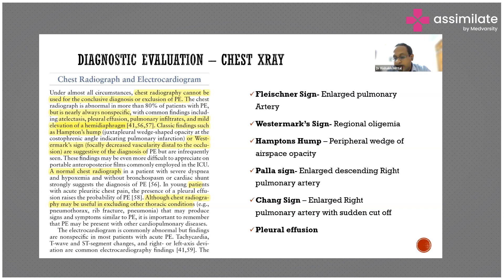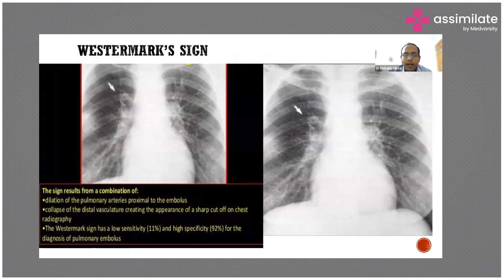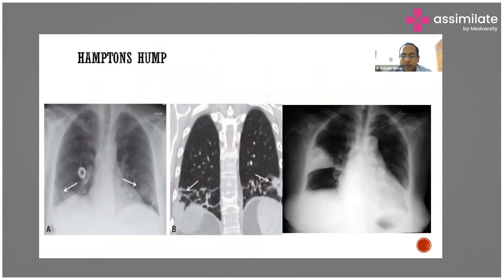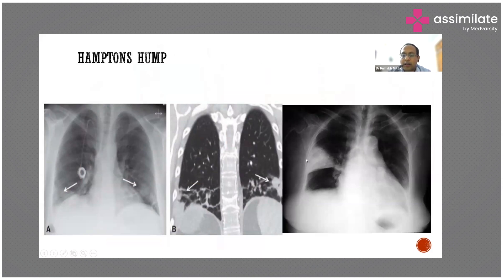Looking at the x-rays: this is Westermark sign — there is hyperemia in the perihilar region, but immediately after there is oligemia because the embolus is stuck and not allowing blood to pass distally. This is Hampton's Hump — you can see small distal infarcts. The middle picture shows a CT scan and the side pictures show x-rays with a wedge-shaped opacity, which is classic of Hampton's Hump in pulmonary embolism.